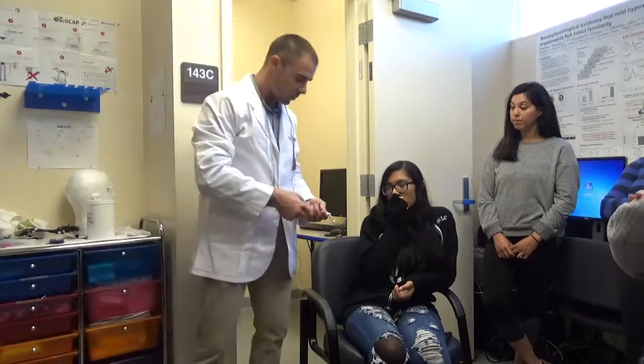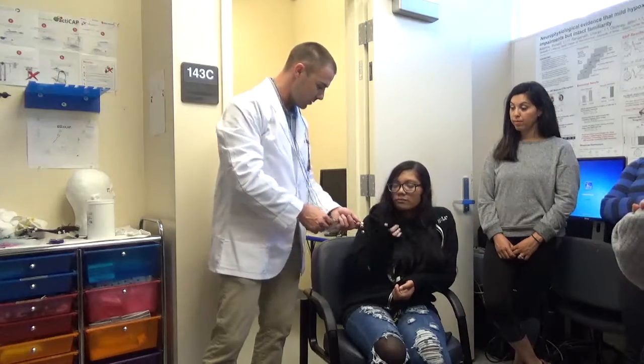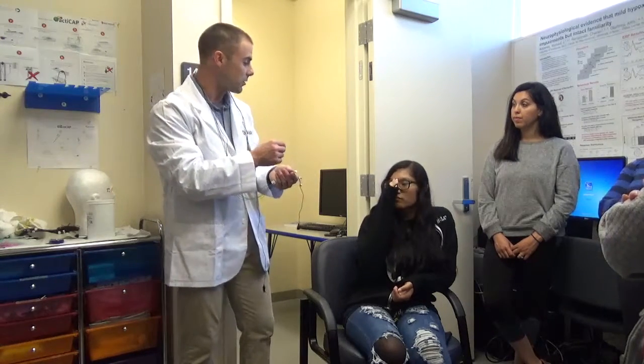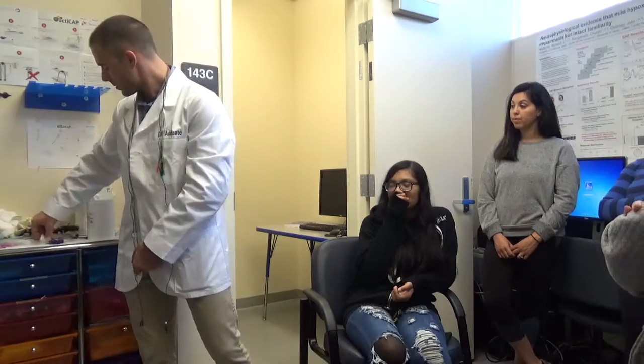And so you can show them that these are just flat electrodes. You know, you can feel that and touch it. It's not going to hurt your eyes or anything. We'll put a little baby dab of gel in there before, and then what we end up doing is we use a little sticker to attach it to your face. These little stickers look like this. They're double-sided, so you stick one side to the face, and the other side just naturally sticks to the electrode.